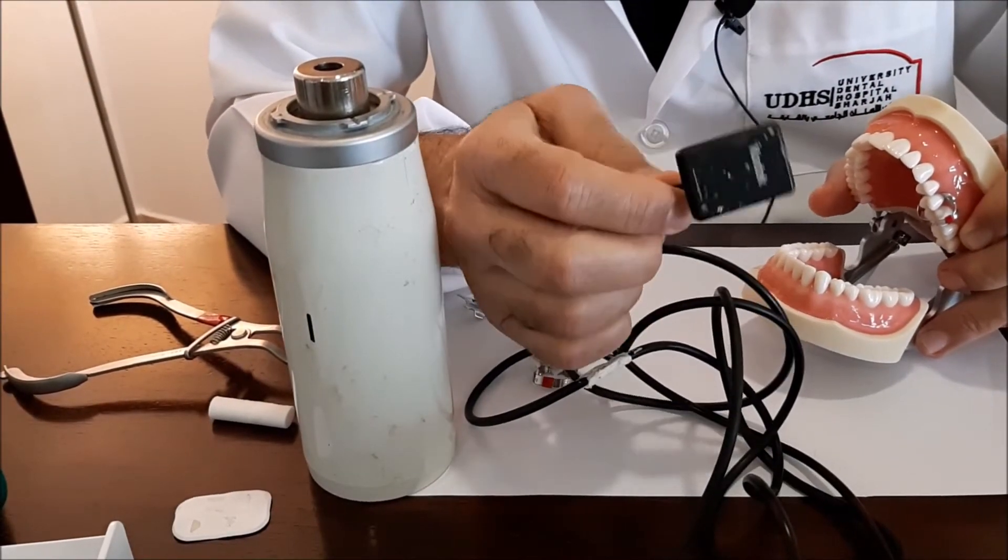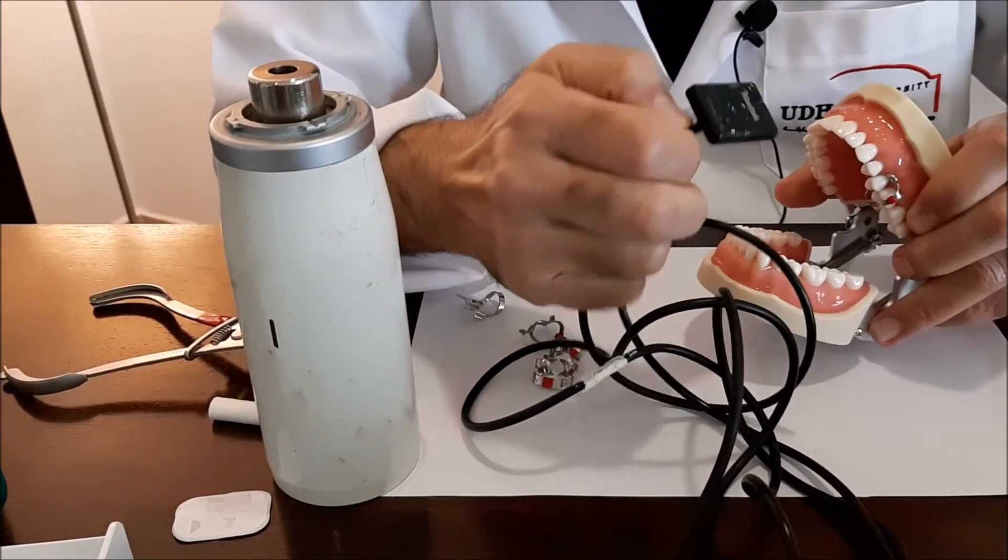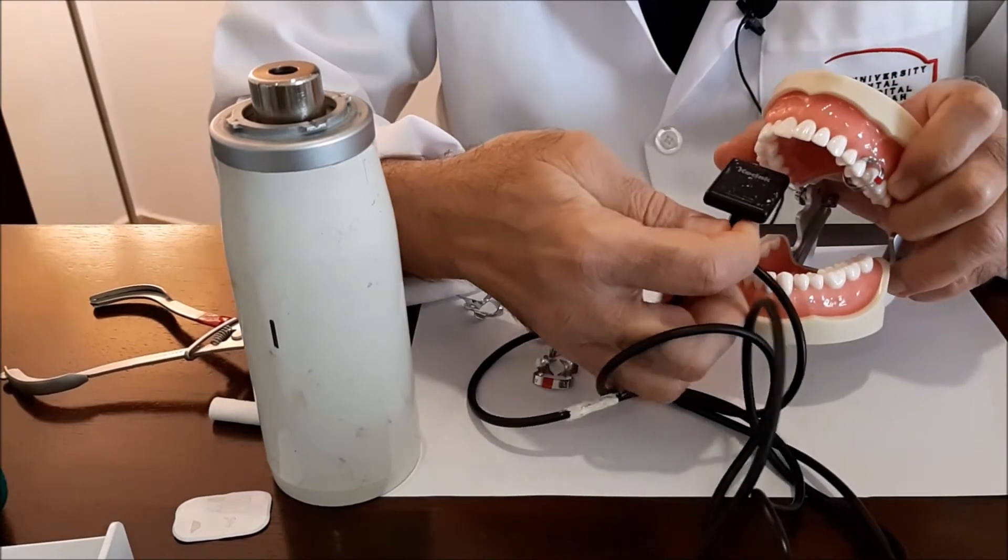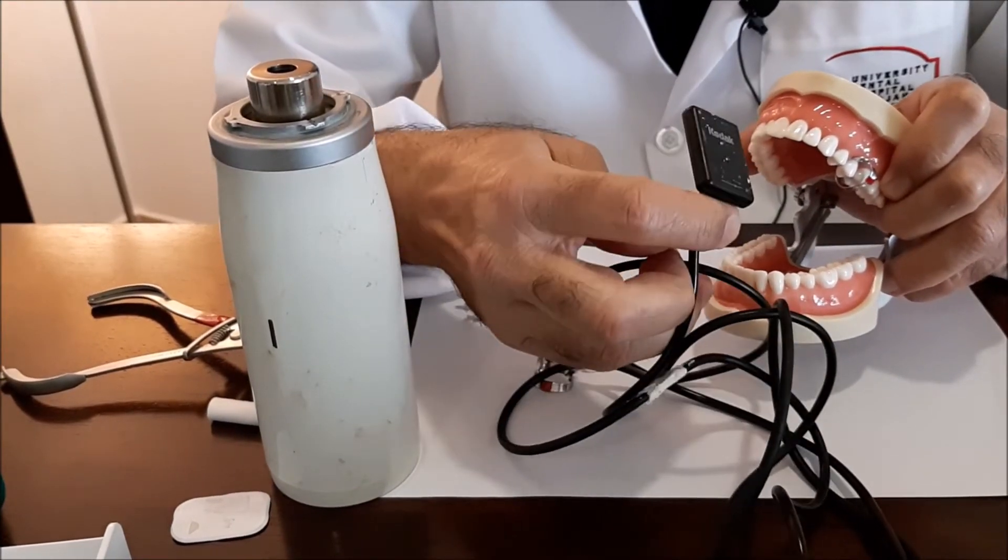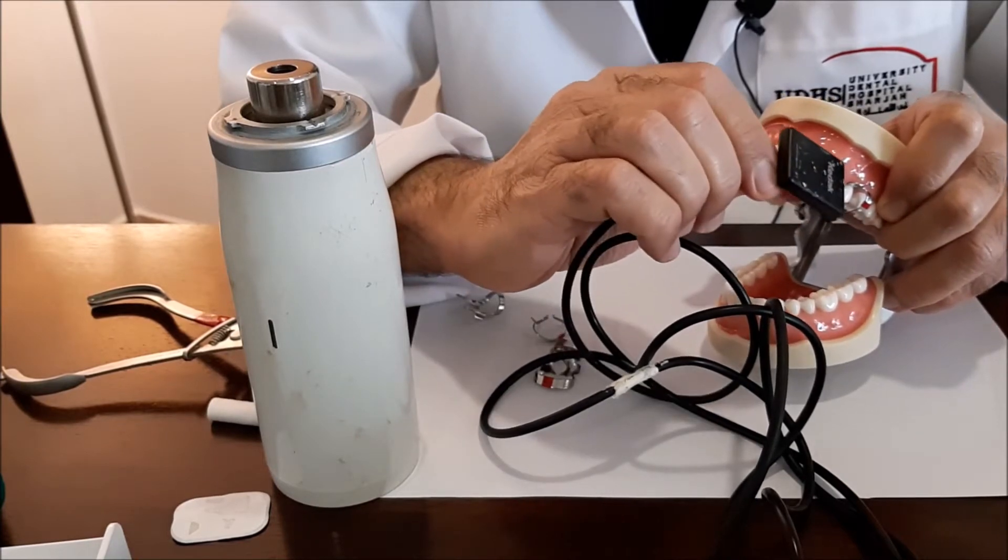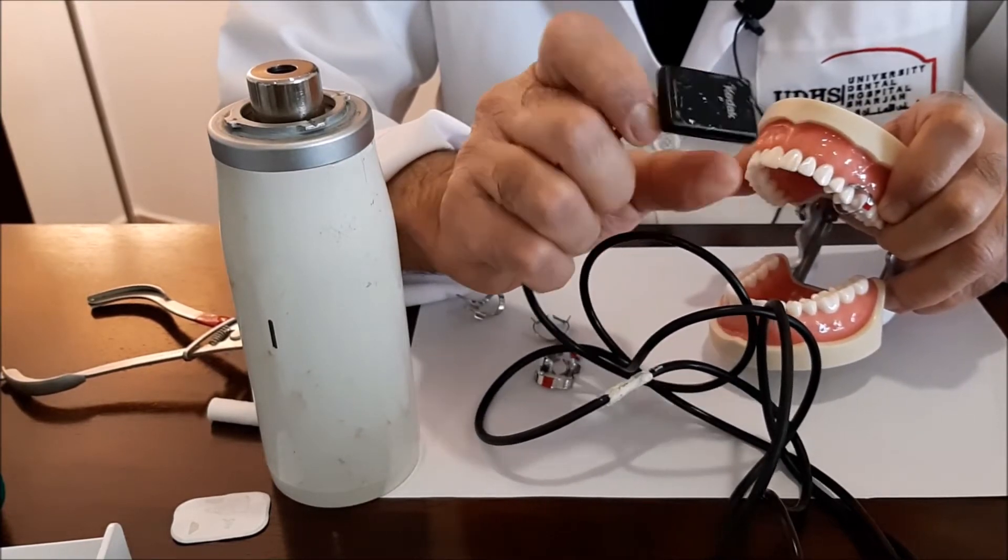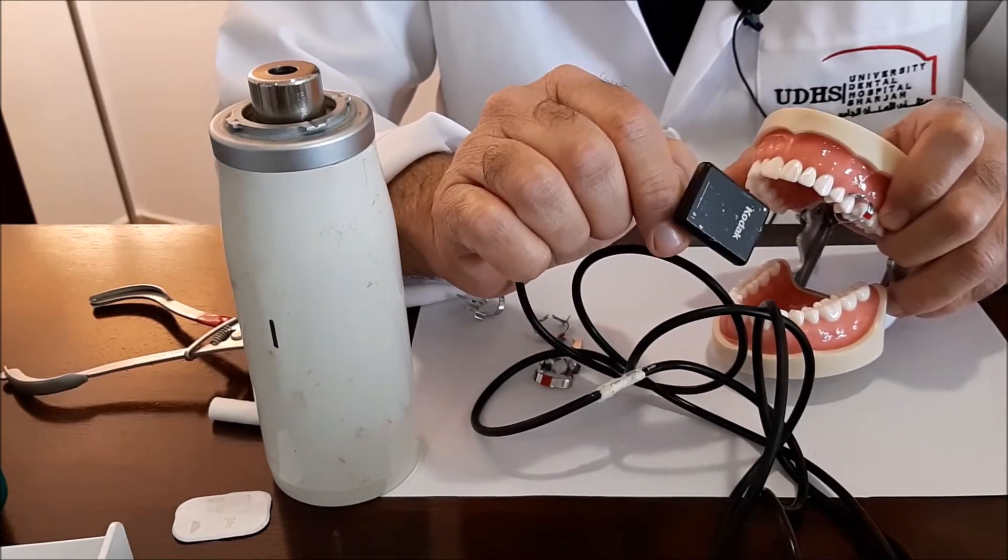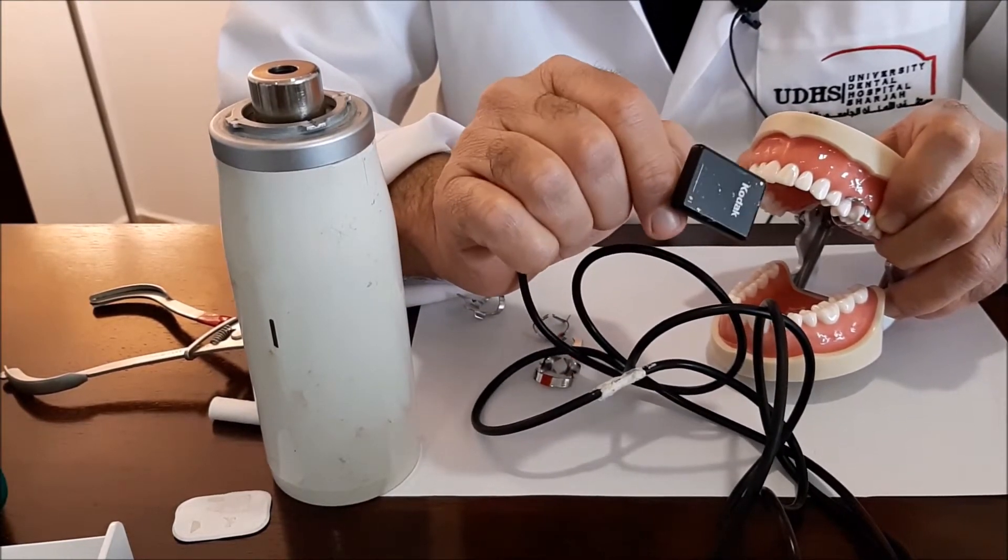First of all, any tooth that is located posterior to the canine, instead of placing the sensor vertically you will place it in a horizontal direction. This is because the roots of the posterior teeth are shorter and this is more convenient for the patient.